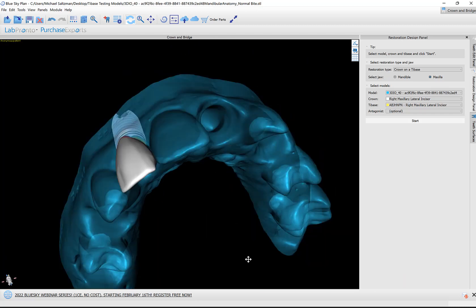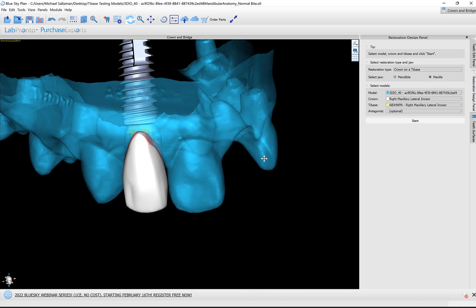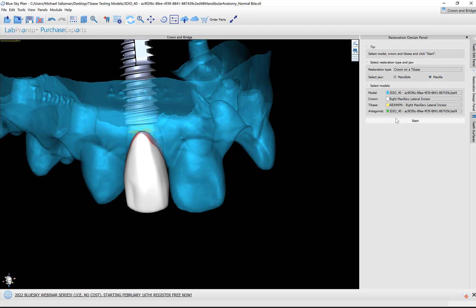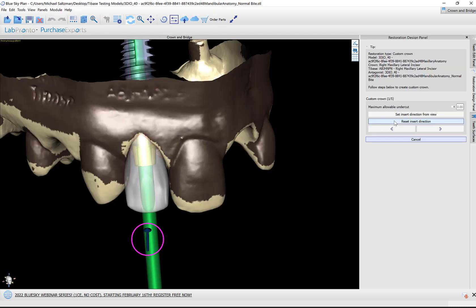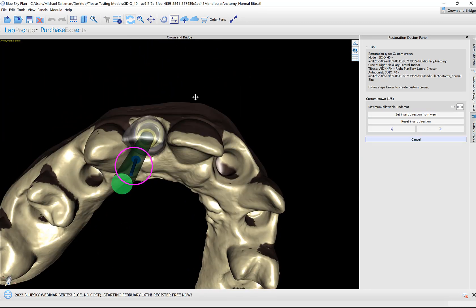Let's go ahead now and switch to our restoration design panel. Restoration design panel: crown on a Tibase, which is what we're doing. Maxilla—confirm the settings here: model, crown, Tibase. We could select the opposing arch and then we're going to click Start. We have a very simple and short five-step process to turn the tooth into a crown.